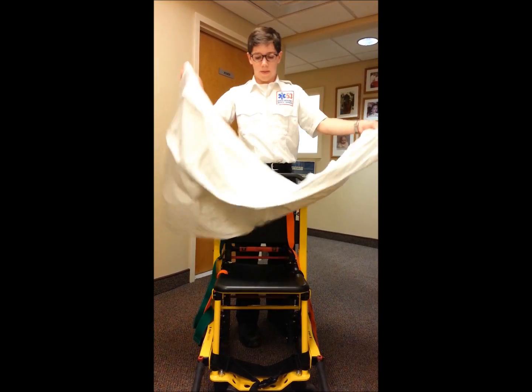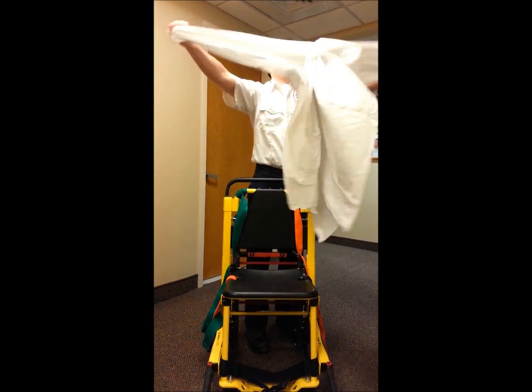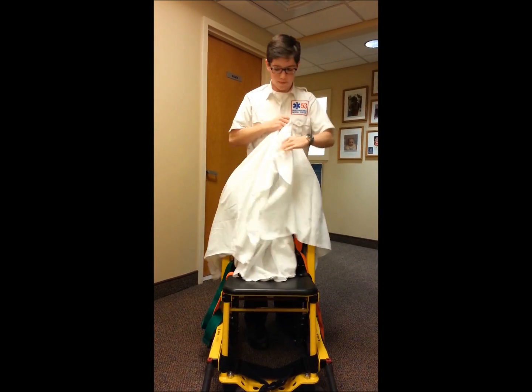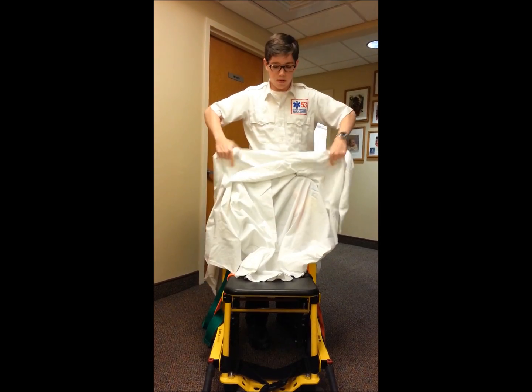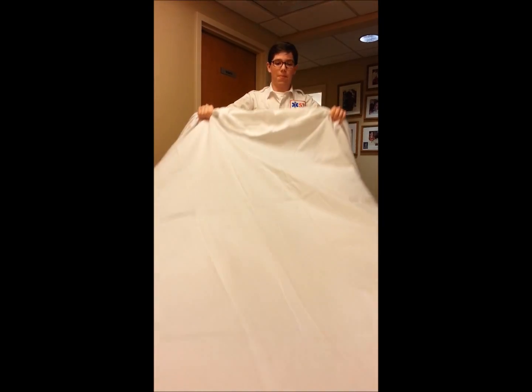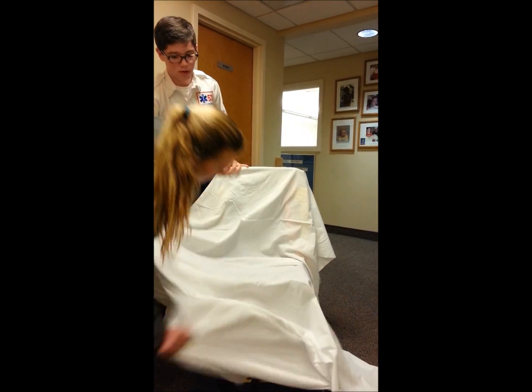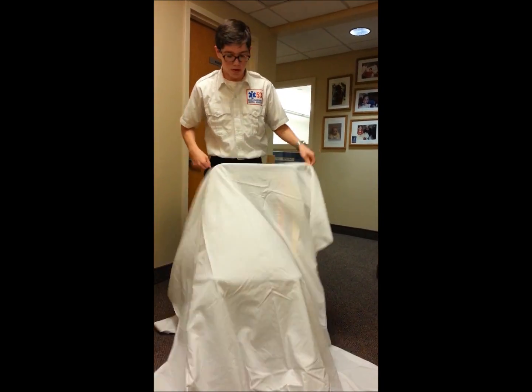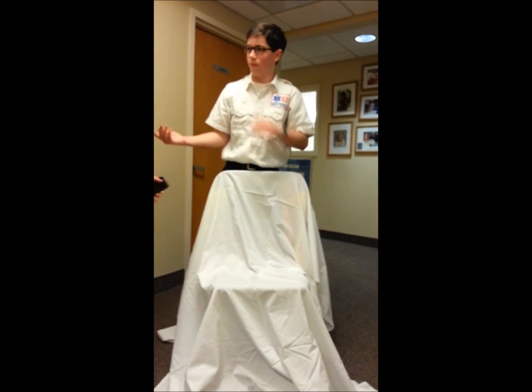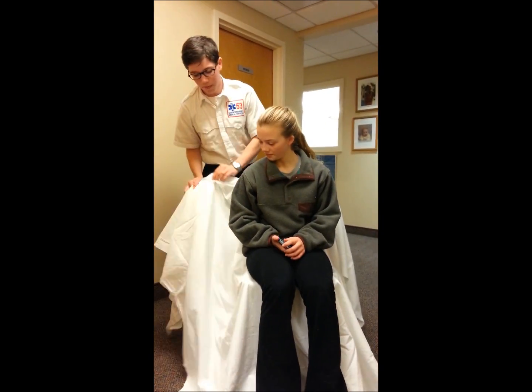You want to open the blanket up and lay it out over the stair chair. Then you want to put the patient in the seat, and then wrap the patient up.